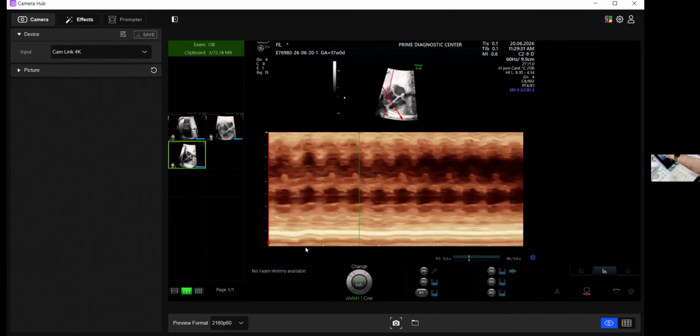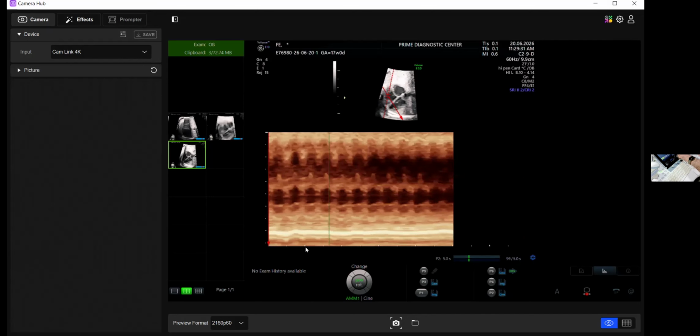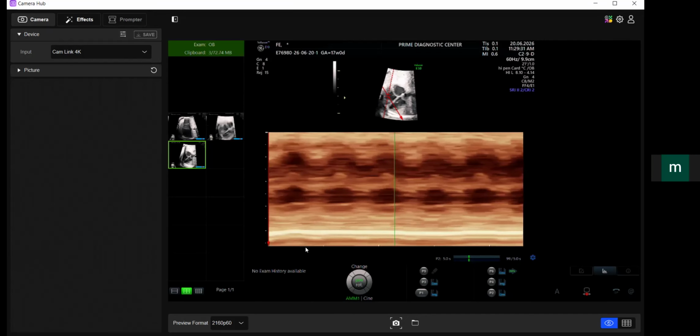Okay. Are you happy with this? Then we go to this, and then we can reduce the speed. We can increase the speed. Okay. Now, sir, good. Done. Yes, sir. Done. You saved. You're not joining adult cardiology.